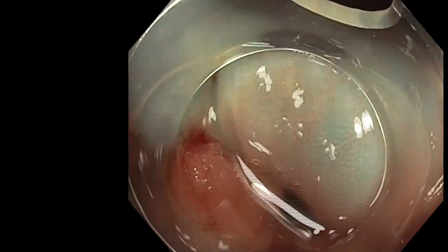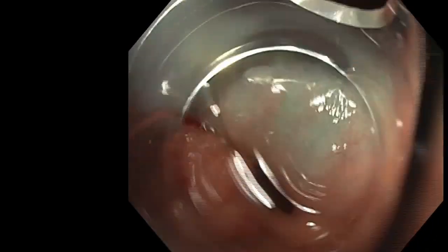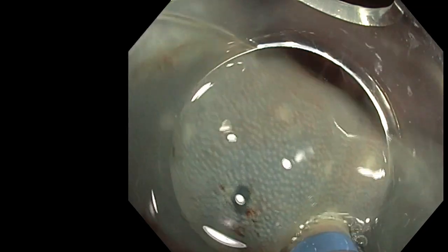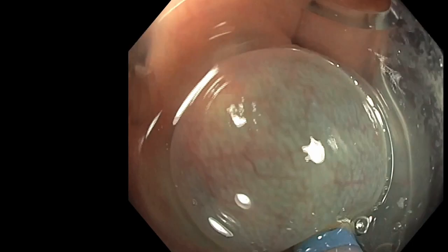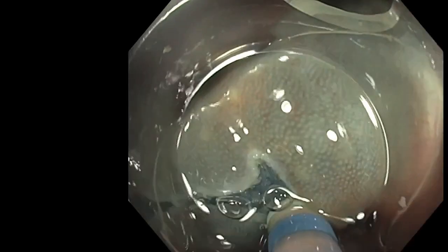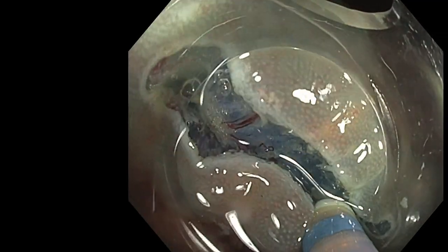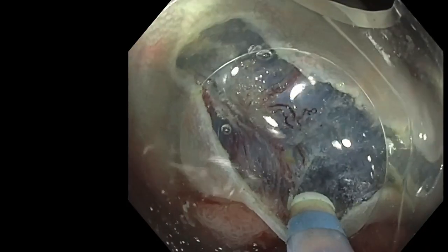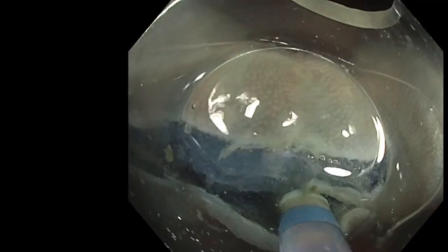It seems difficult to do because you are not tangential, you are obliged to do down, but in fact it will be possible to do the incision because the injection is very strong, and immediately the trimming, which is down on the edge, but on the good edge. I mean, it's not an opposite trimming to the oral side of the incision. It's a good trimming in the anal side of your incision, and it's very important.